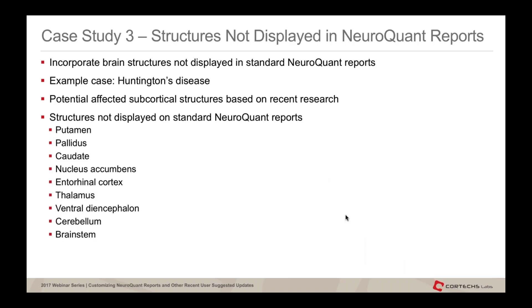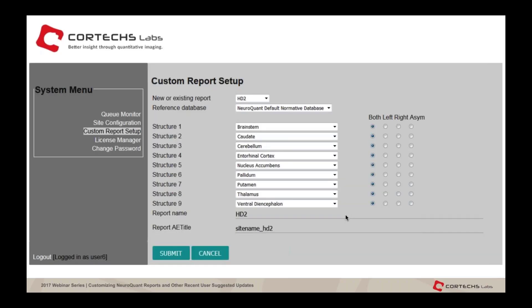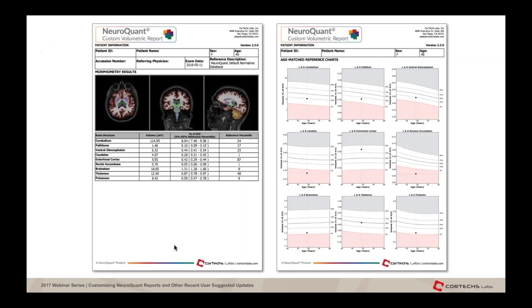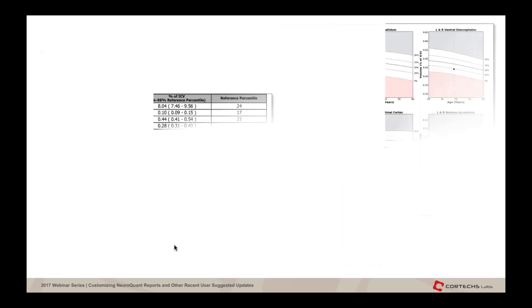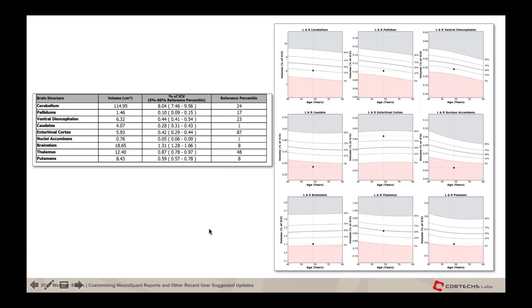A third example is for Huntington's disease, evaluating structures not available in standard reports: putamen, pallidus, caudate, nucleus accumbens, entorhinal cortex, thalamus, diencephalon, cerebellum, and brainstem. Here we used a previous existing report and altered it by changing the existing report, pre-populating the structures and making our changes before saving. The output has the same report structure showing results for this particular patient.